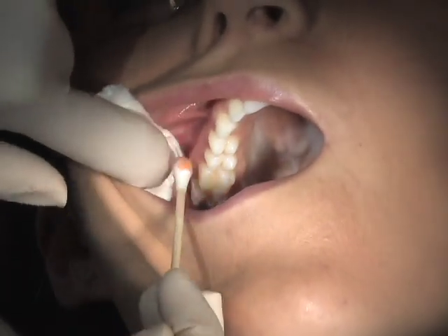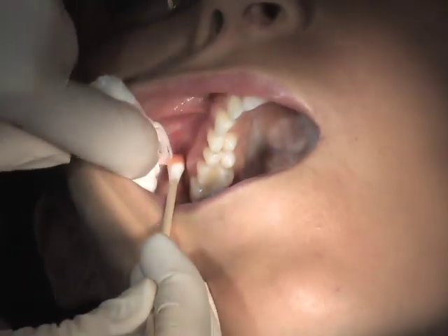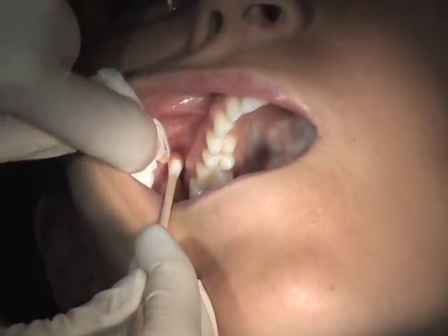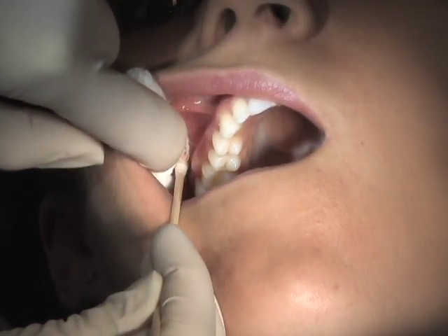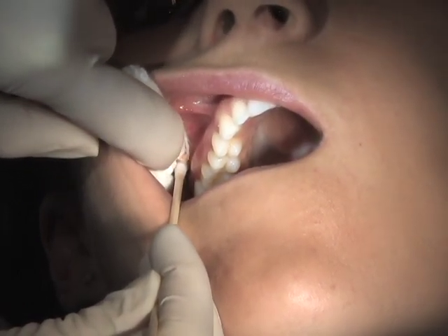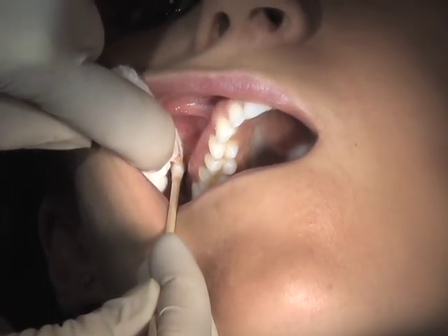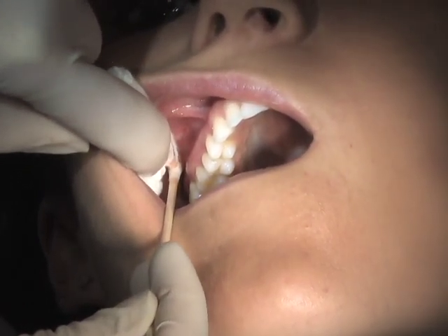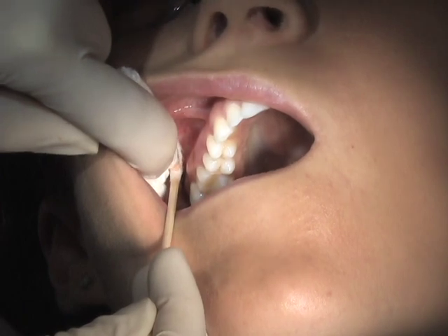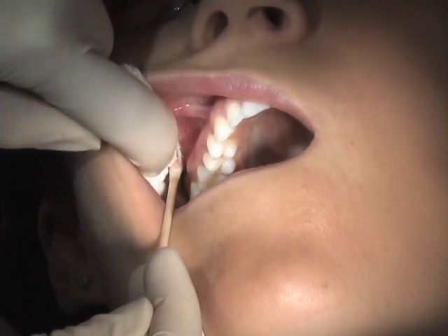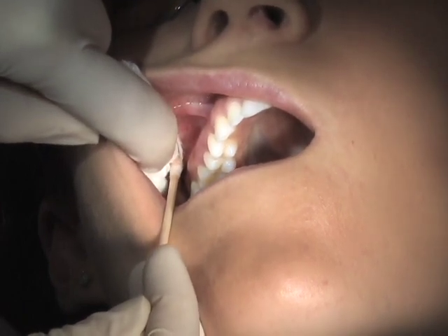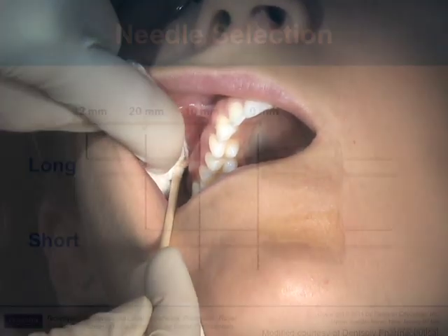Place topical at the height of the mucobuccal fold over the distal portion of the second molar or at the end of the zygomatic arch, which you should be able to feel with your finger up in the vestibule, whichever landmark is more distal.